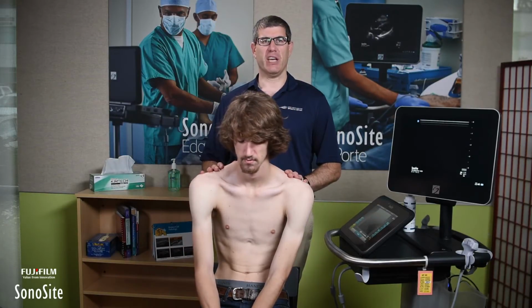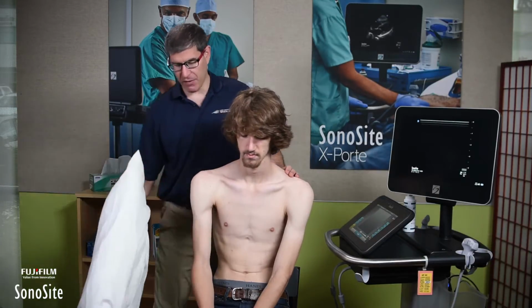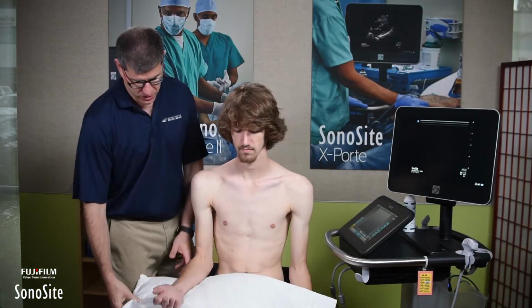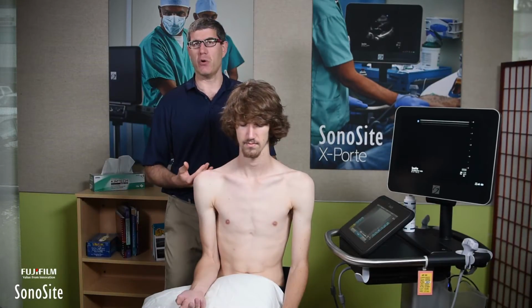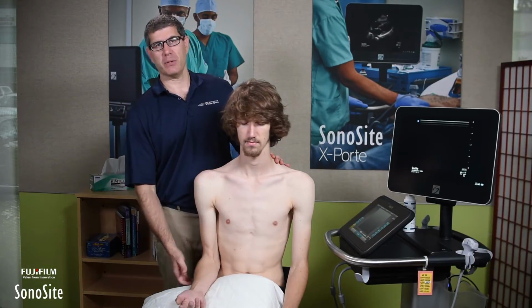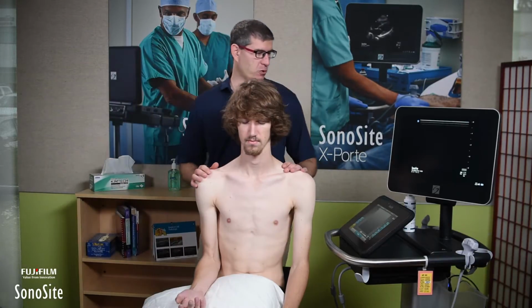not ideal for scanning. So one of the pearls that I love to use is to have a pillow on the waist of the patient and have the arm centered towards the weight of the pillow. And what we find is that for most patients, their arm length plus a pillow length equals that of the trunk. So that's going to be the first pearl.